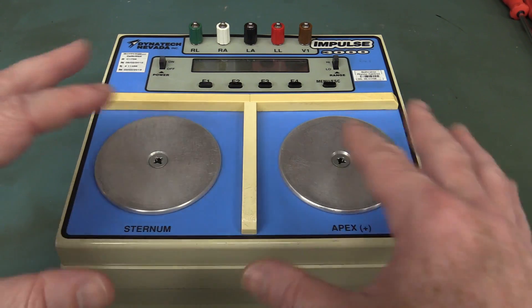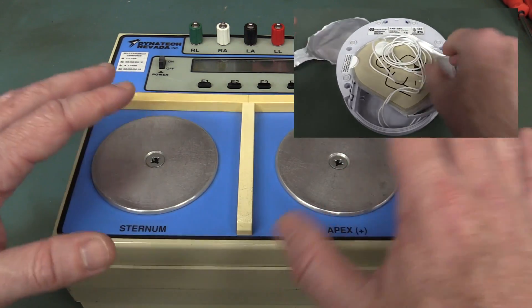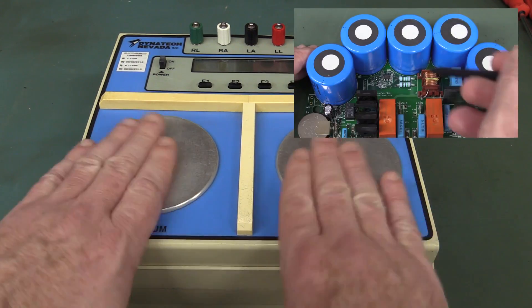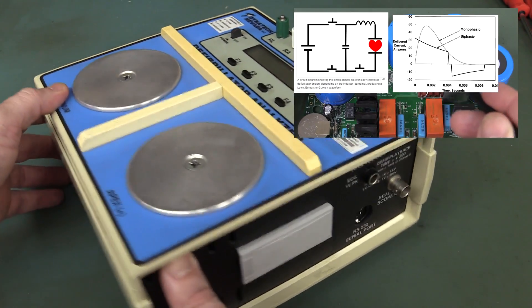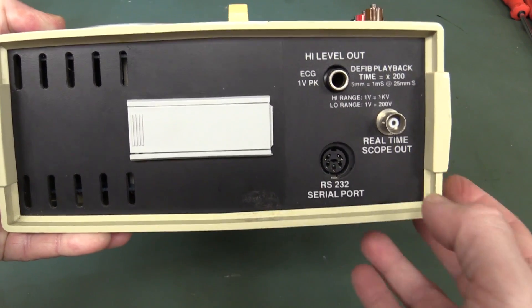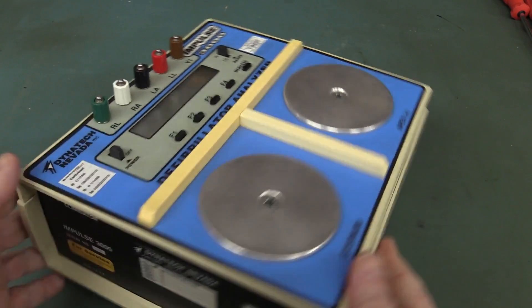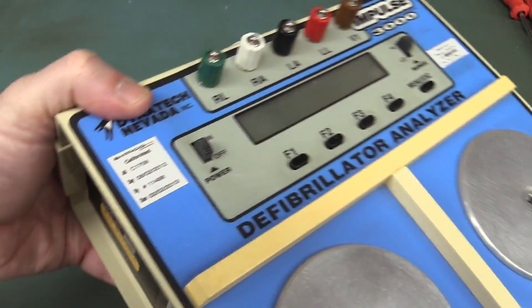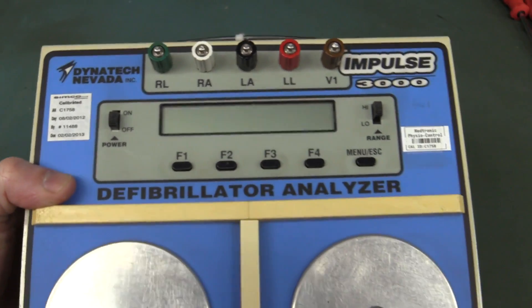Like, you've seen these defibrillators - I've done a teardown I believe, I'll link it in down below - where you have the test pads, like the chest pads, where you put them on the sternum and the apex. I can put my hands over here because it's not going to generate a high voltage on this thing; it's designed as a load-based tester device. It's got a scope output on it, RS232 serial output, it's powered from a 9 volt battery, and it's done by Dynatec Nevada, made in the USA, with pretty recent calibration.